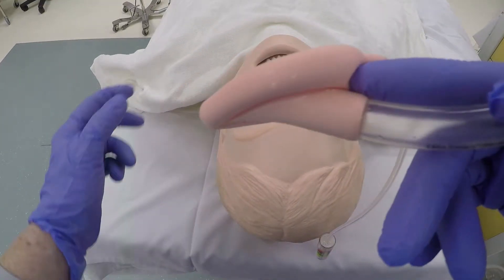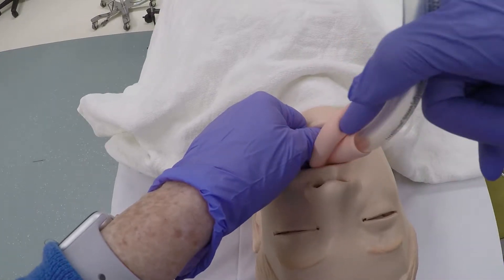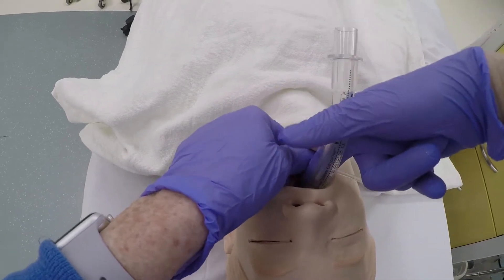Hold the cuff like a pen, as close as possible to the mask end. Use your index finger at the point where the cuff joins the tube to guide the LMA along the hard palate. You should insert with one fluid movement. Sometimes gentle partial rotation of the LMA helps the tip clear the back of the tongue.